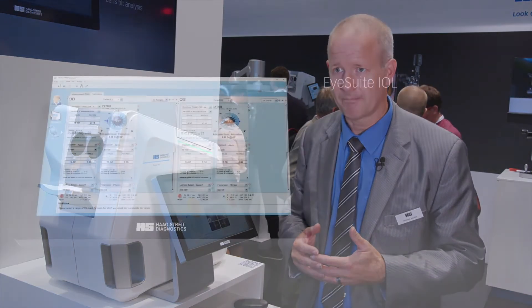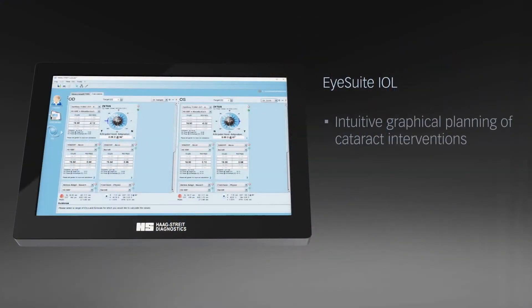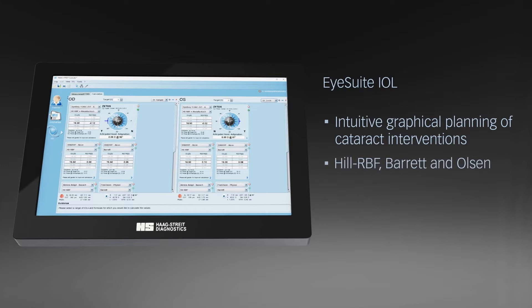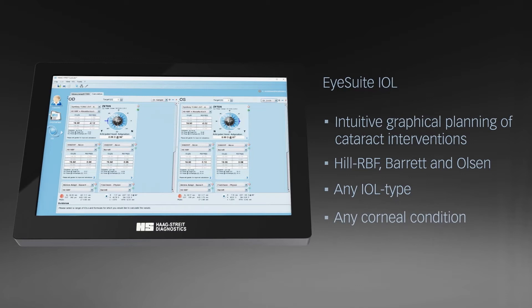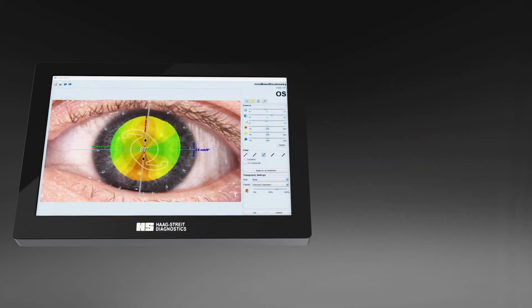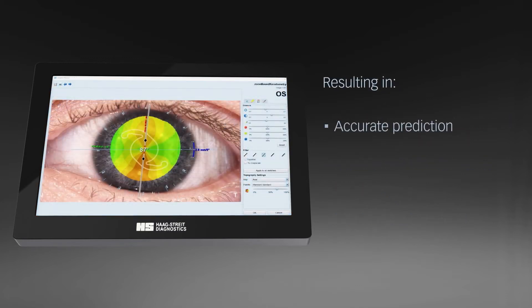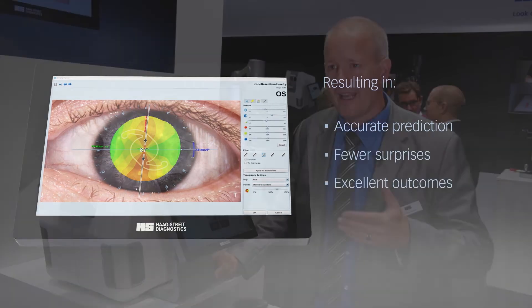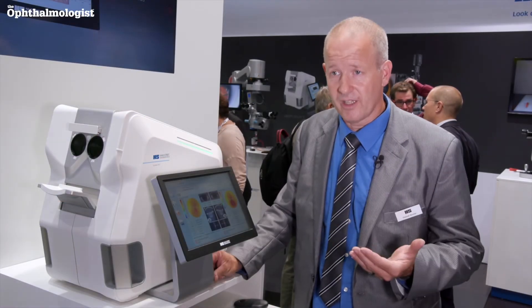When you do surgery, efficiency in your practice is one of the key points. Having this device allows you to delegate the measurement and then focus on counseling the patient — to get the right procedure done, the right implant selected, or the right surgical approach identified.